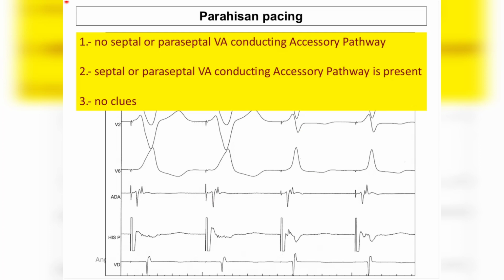No, I would also like to stress that even now the morphology of the atrium is not modified. So we can say that most of the atrium is depolarized through the accessory pathway. It's a very fast conducting accessory pathway. Right, absolutely. It's an impressively short VA interval. The pacing site must be really close to the ventricular insertion of the accessory pathway. Probably Parahisian pacing, or a Parahisian accessory pathway. Yeah.